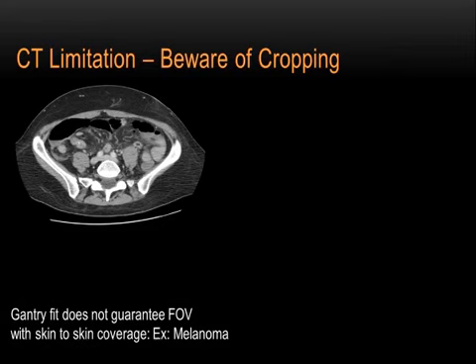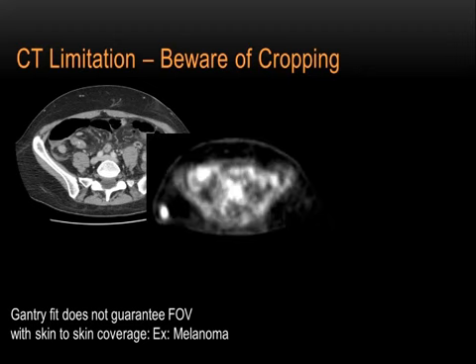Now, the other thing that I mentioned was the field of view, right? It's important to realize that many times the reconstructed field of view or the scan field of view may not be sufficiently big to include all of the patient's anatomy. In this case, as you can see, we do have some clipping occurring in the lateral abdominal wall, lateral pelvic wall, and most often it should not be an issue, except that unfortunately this patient happened to have melanoma. We did a PET CT, and you can see that there was this very bright hot spot, obviously a metastasis from melanoma, right, that we had excluded.